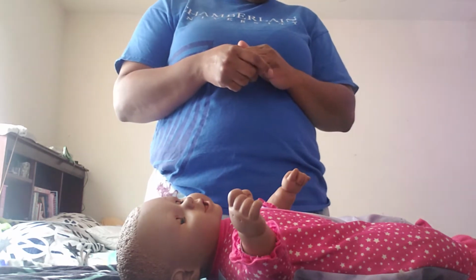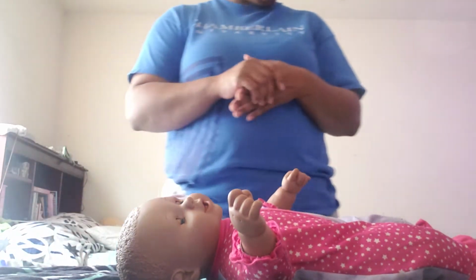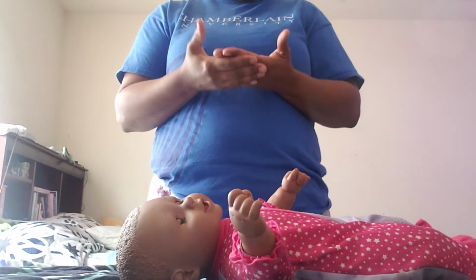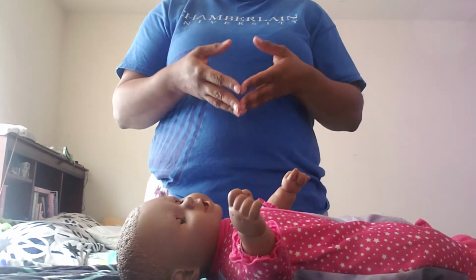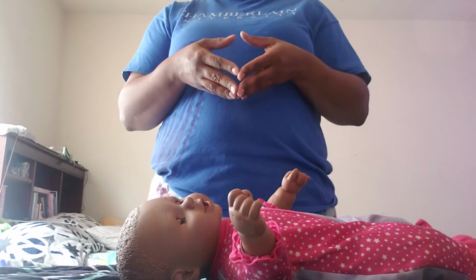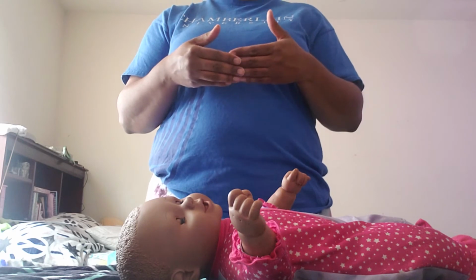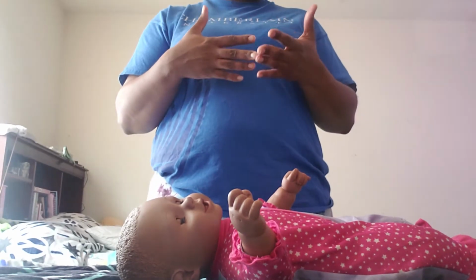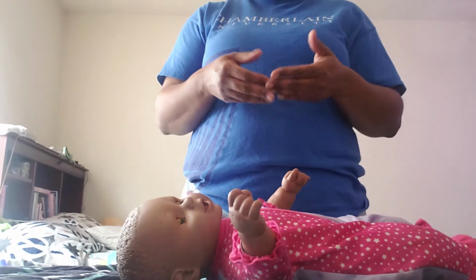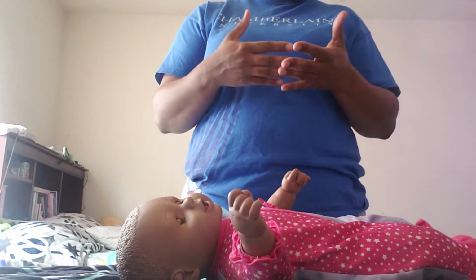Then I will have my supplies on a clean surface, have everything that I need there, and then I'll go ahead and perform hand hygiene. I'll inform the patient the reason for the NG tube is because of the bowel obstruction. Once we insert it, you should feel your nausea go away and any pain that you have associated. You may have a little bit of discomfort during the procedure, and you may gag once it's removed.